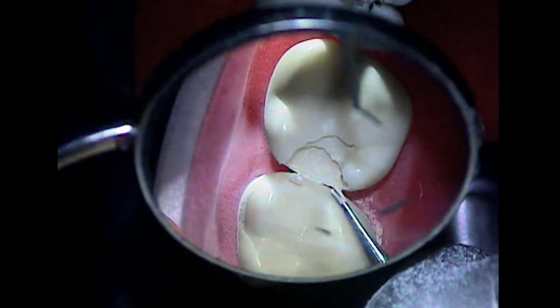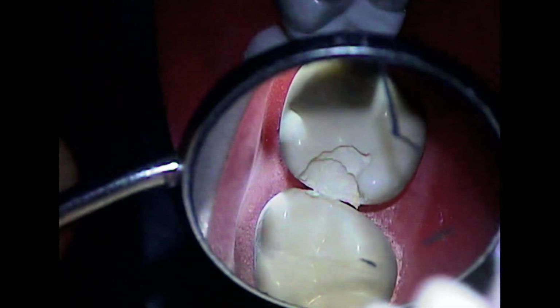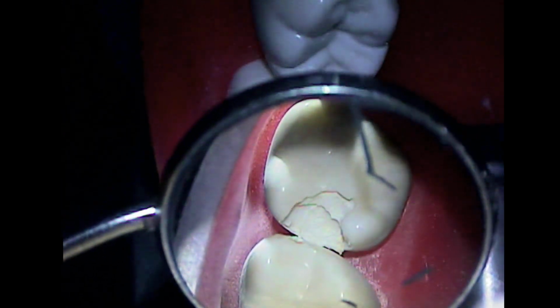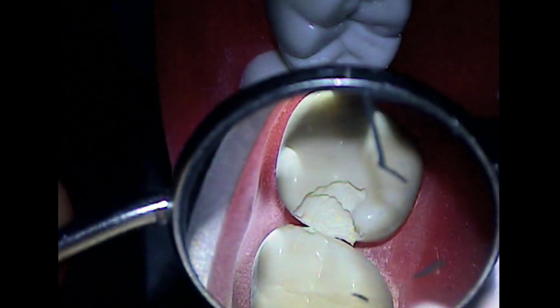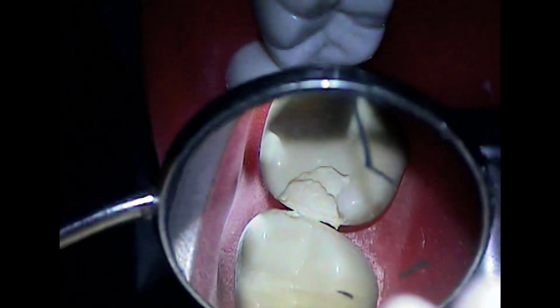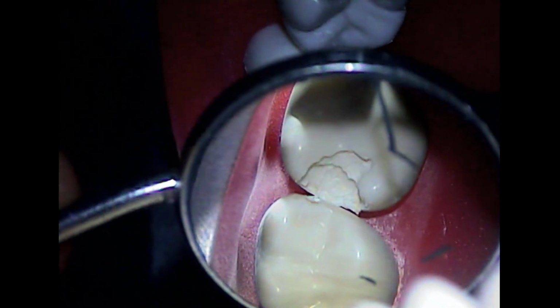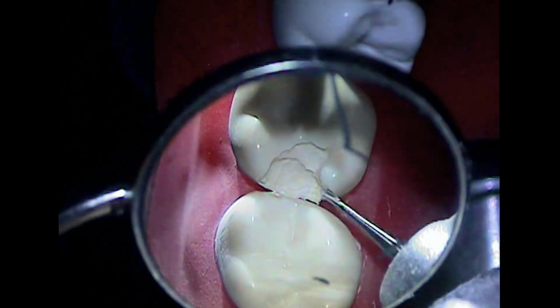Okay, so the DO over here. So, what do you think so far? What's your biggest problem? Gingival wall. What about it? And axial wall. So your facial wall is a little bit acute, but at least it's straight. The lingual wall is not straight at all, is it? It's very irregular.